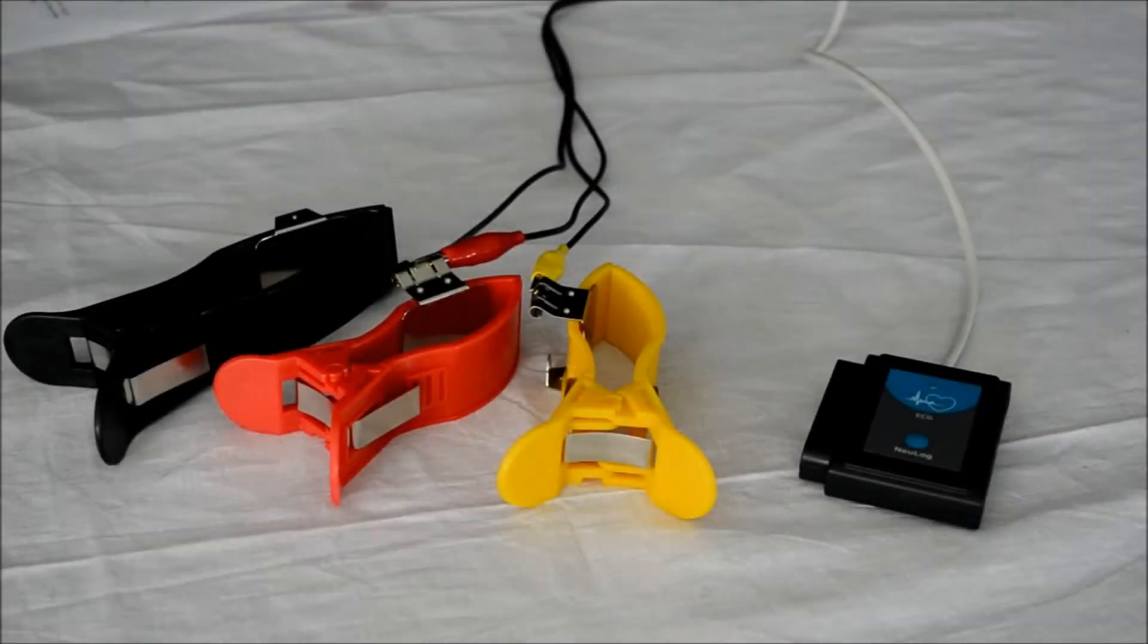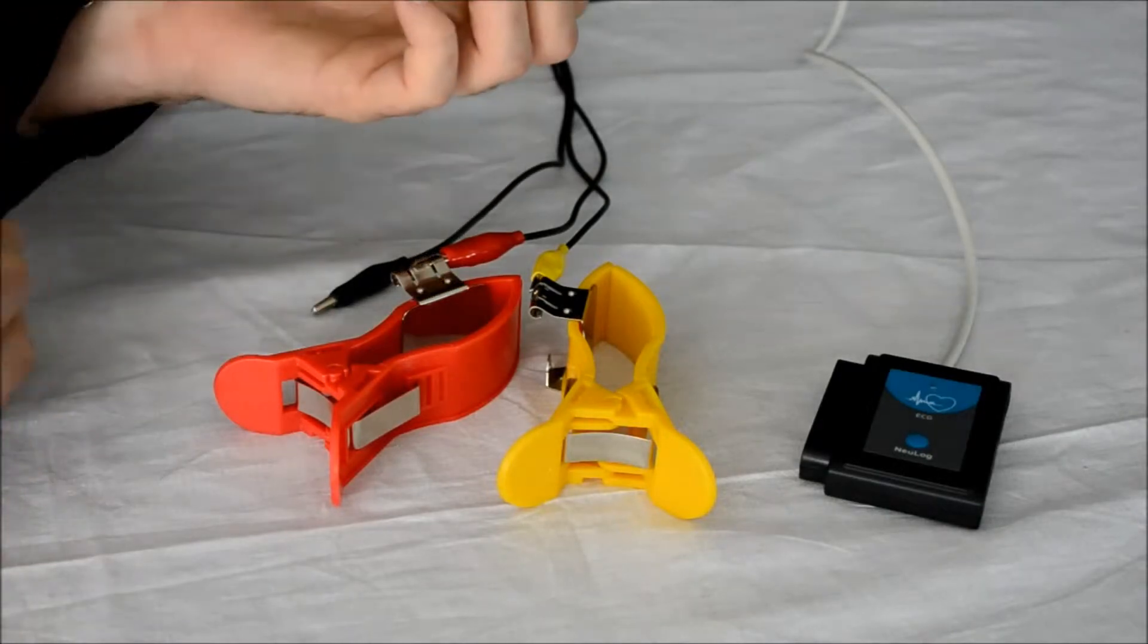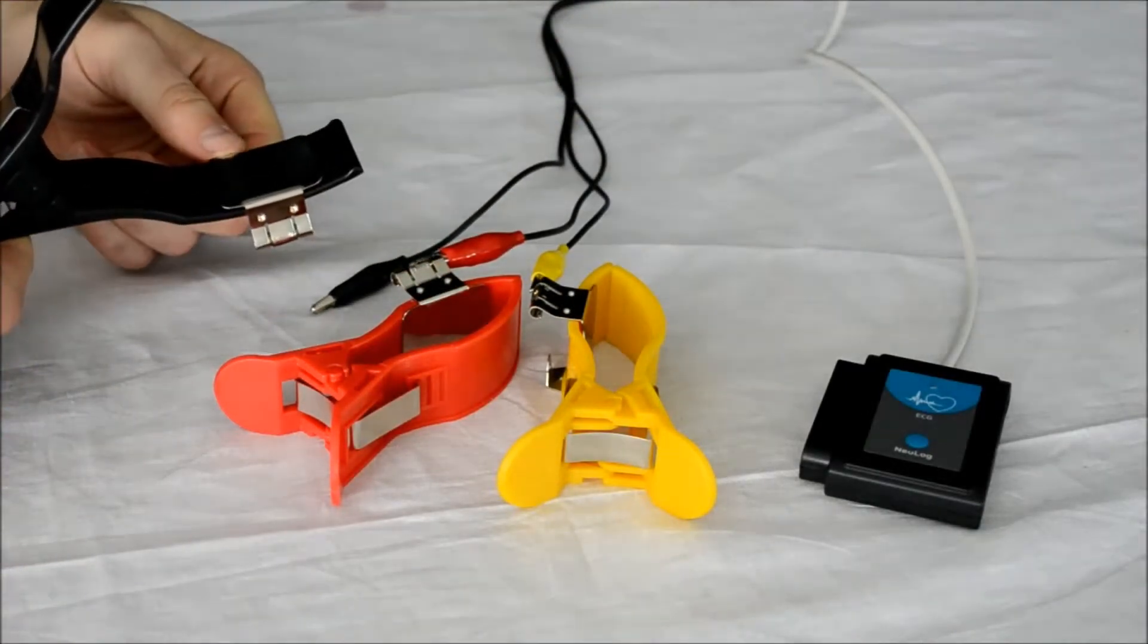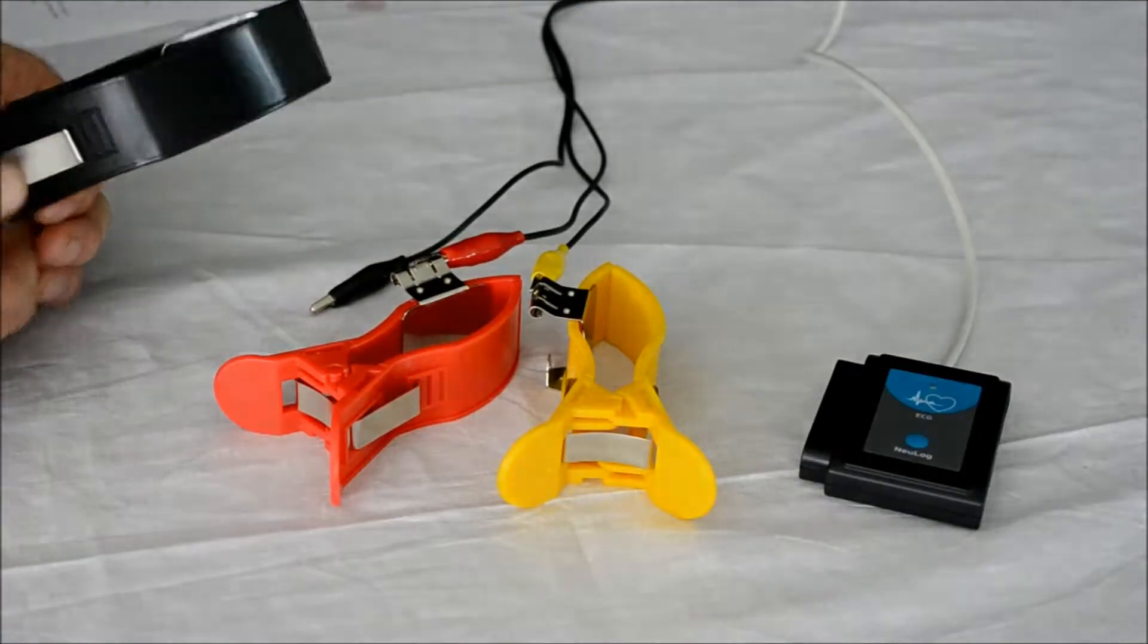The NeuLog electrocardiogram sensor comes with these three reusable clips that connect directly to your arms or legs. On the inside of each clip is a metal plate that is very sensitive to minor fluctuations in electrical conductivity.